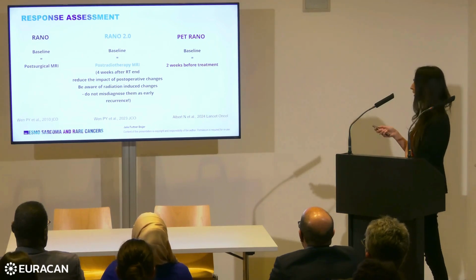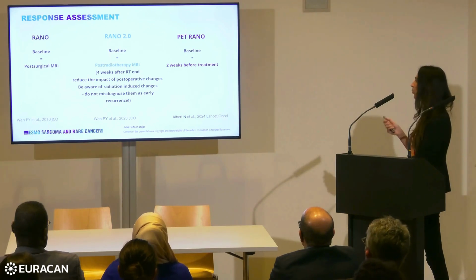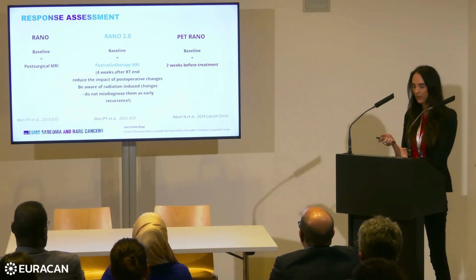And in the PET RANO criteria, it's kind of easy. You just do the PET examination at least 2 weeks before treatment.